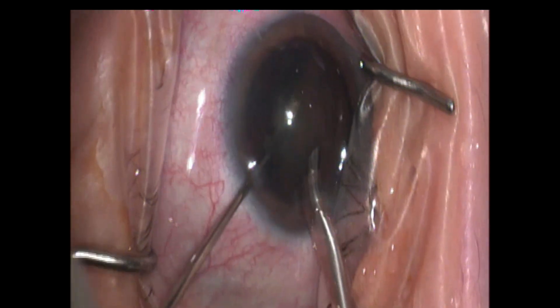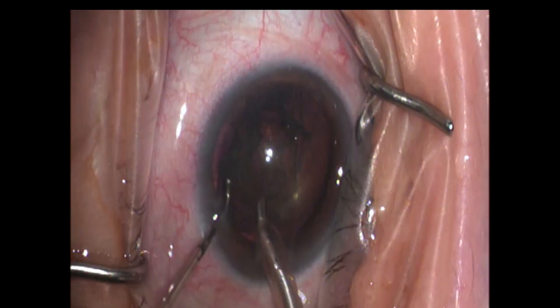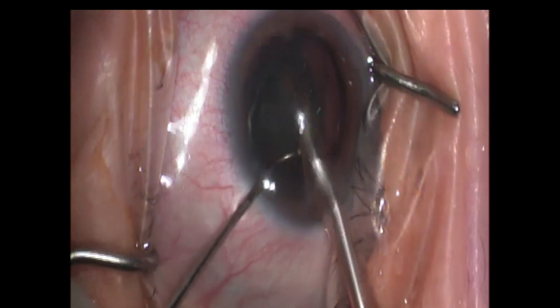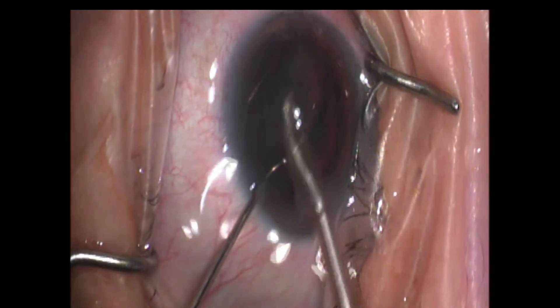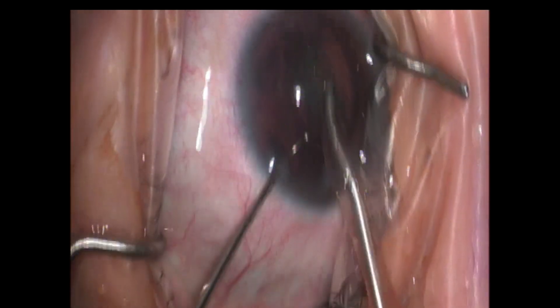So we're just going to leave it as one piece and I'm going to start the actual procedure on my quadrant removal setting. Here you can see that we're just taking it out on the quadrant setting. I'm keeping it in the anterior chamber and using a very low amount of FACO power to get this thing out.